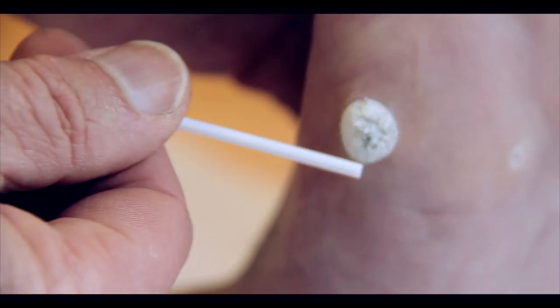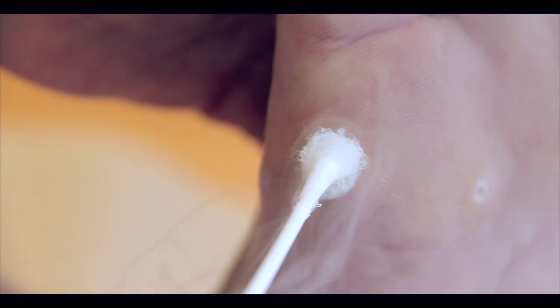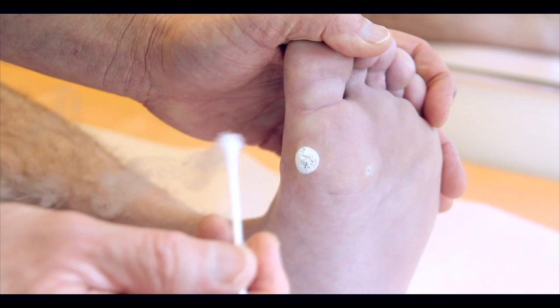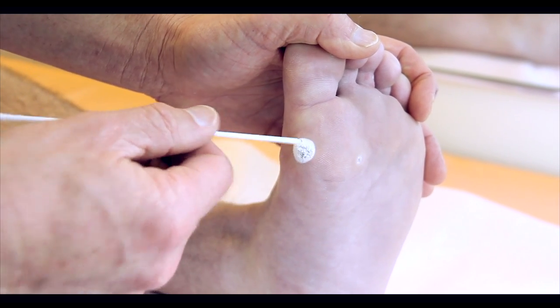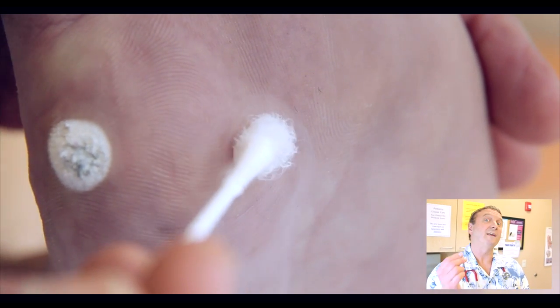We've got a rim of white frozen around the bottom there. We'll do a little more on the top. The goal is to get about one millimeter of normal tissue frozen. I think that's the part that hurts. We're getting a little rim. One more time and we're done with this one. The small ones will be quick because they're just tiny. I'm just going to real quick touch those small ones. If they do happen, I just wanted to remind you to leave them alone.